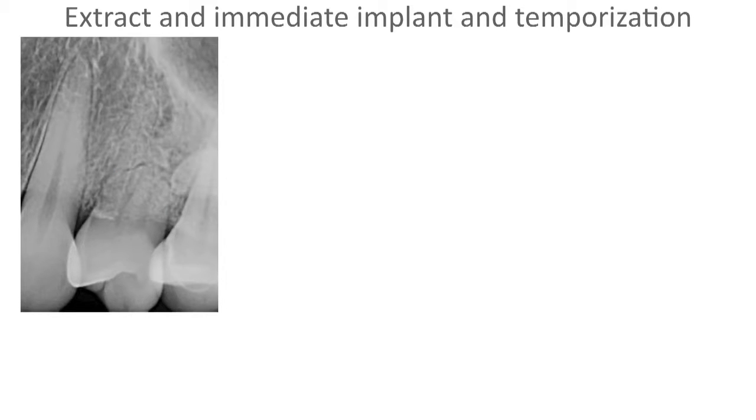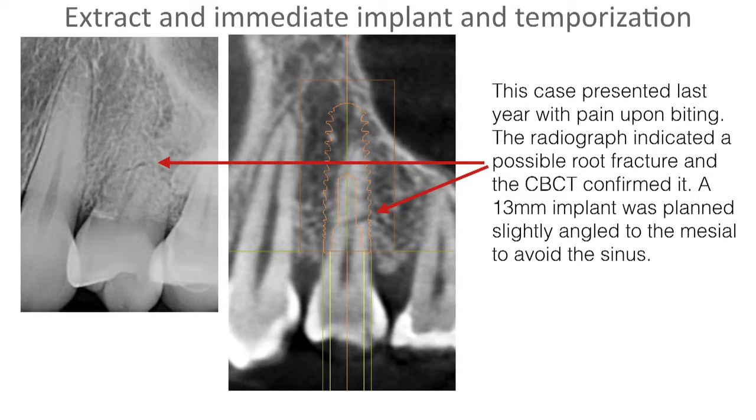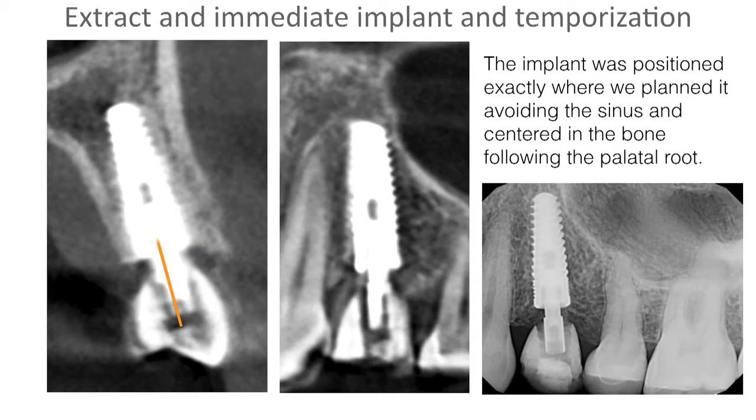Here's an example of immediate extraction. I'll give you one of the things we planned here. This is a fractured root. And so a 13 millimeter implant was planned, slightly angulated, and I'll show you why. We wanted to avoid having to deal with the sinuses at all, so we knew we could slightly angle the implant, but still get an excellent result with it. So we did that slightly to the mesial. All we had to do was follow the palatal root and plan how we're going to off angle it to avoid the sinus, and this is what we ended up with.